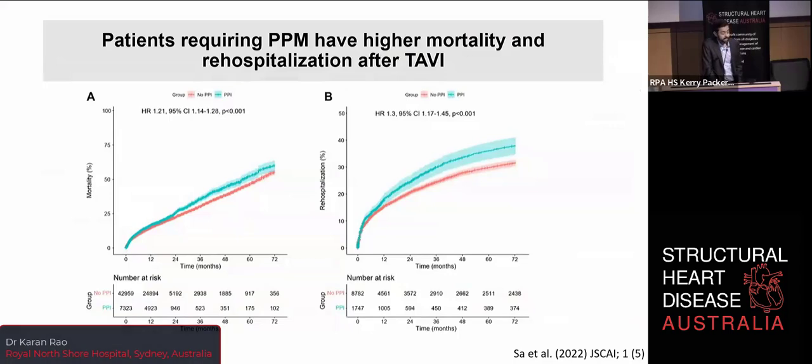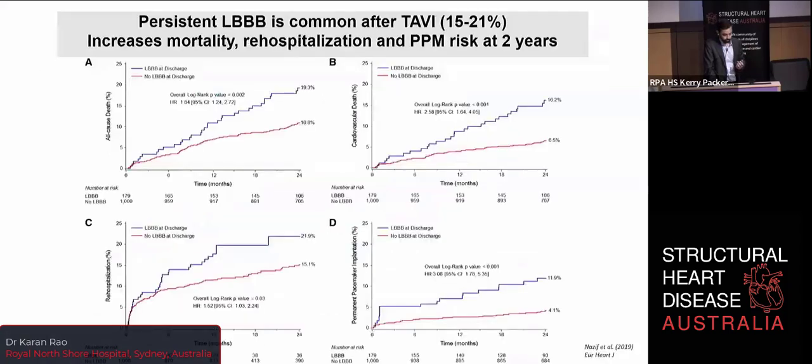And, well, pacemakers with leads can often interact with the tricuspid valve and lead to significant TR, again, contributing to morbidity. And if we're putting in TAVIs in younger and younger, lower risk patients, I think we have to be more and more mindful that prophylactic treatment is not really the answer. Better prediction and prevention is probably the way of the future.